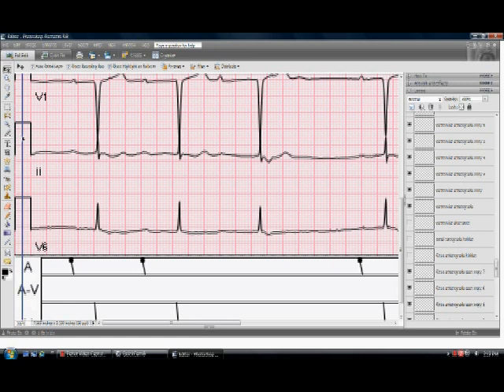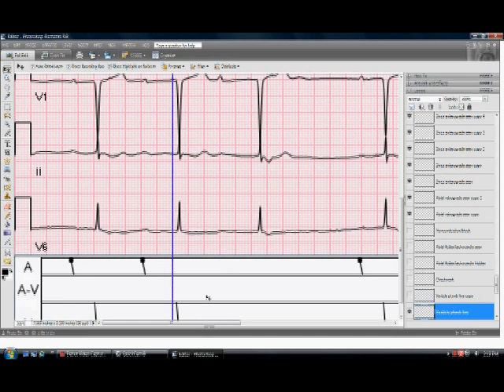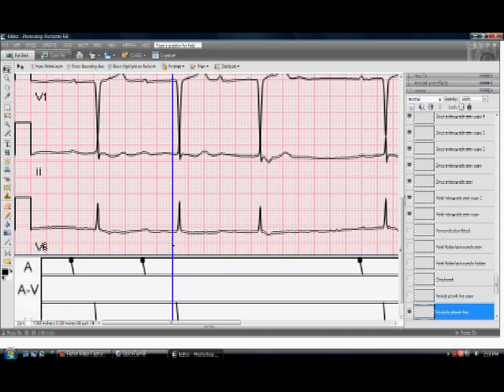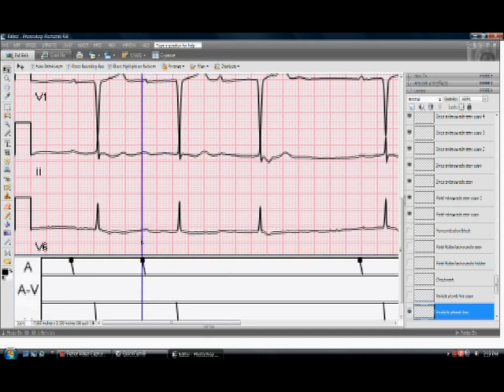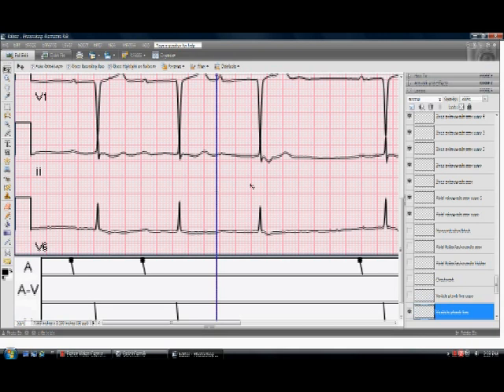I have this blue plumb line which extends the entire height of the ECG and the Laddergram. What I'm going to do is put it right at the beginning of the P-wave, the sinus P-wave up here in lead V1. Whoops, I'm on the wrong beat. Go over this one next door.